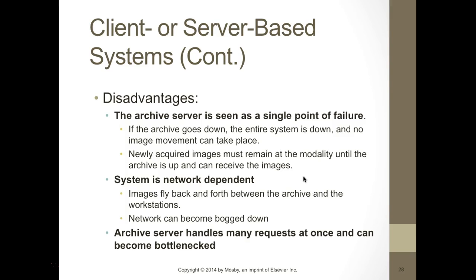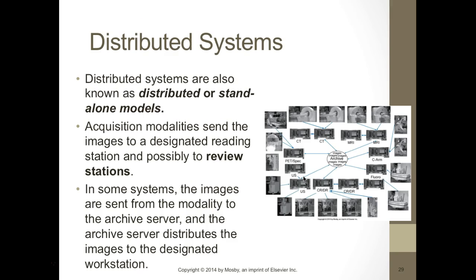So if I'm looking at an image on a client or server-based system and the radiologist wants to read it, I have to sign out. So you have to call the person who's on it and tell them to get out of it so that they can read it. So if you left for the day and left that patient up on your monitor, the radiologist would not be able to read the study until it was closed out. So that created some problems using the system.